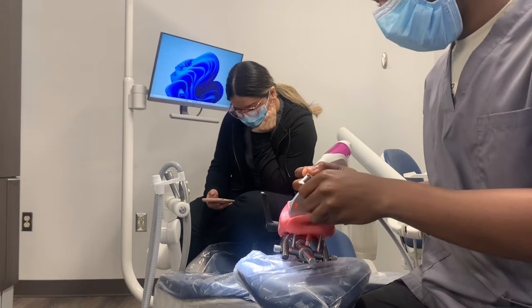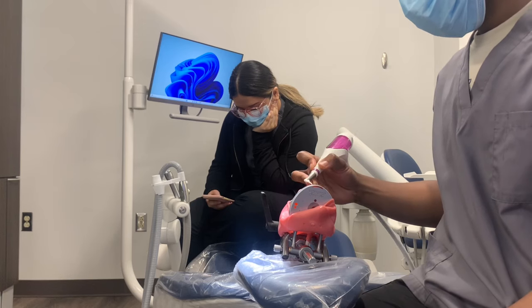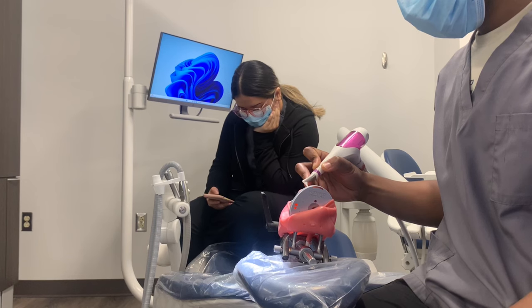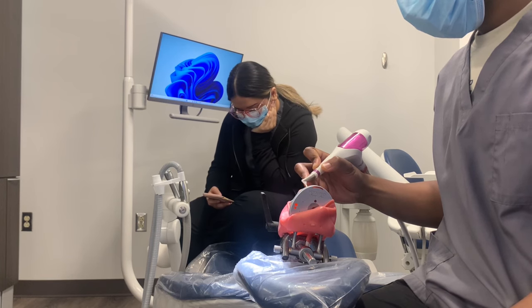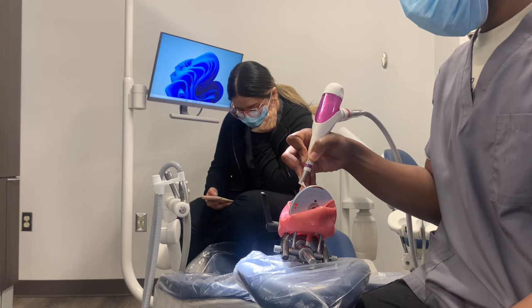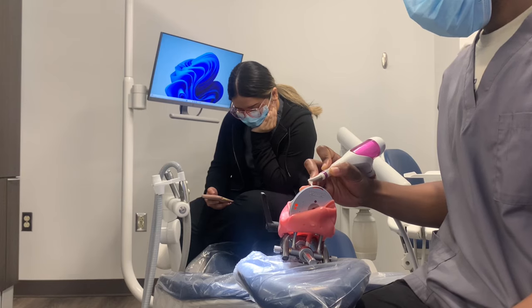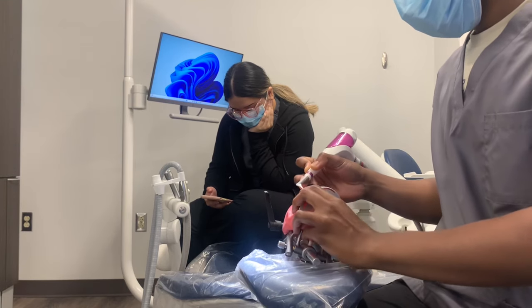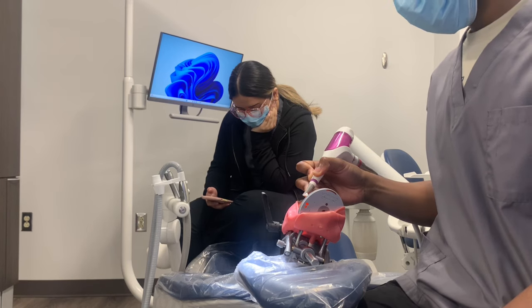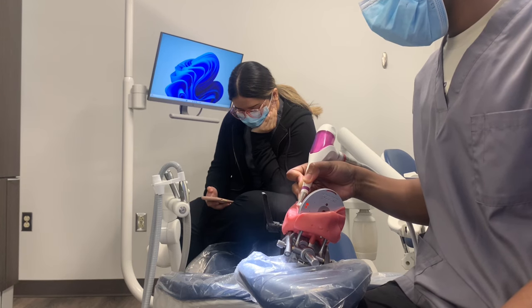So here we are — we are practicing our air polishing. Air polishing uses this instrument, basically like a little gun, and it has powder and water that mix together. You press the rheostat button, which activates the powder and the water, and it will penetrate your pockets — your deep pockets — and remove plaque and biofilm from the surfaces of your teeth. This is a really good tool for people who have deep pockets, and it's great to use to remove plaque and biofilm even before you start scaling.